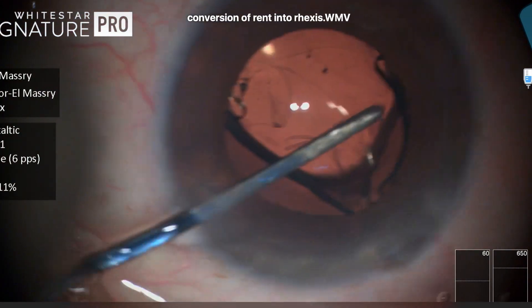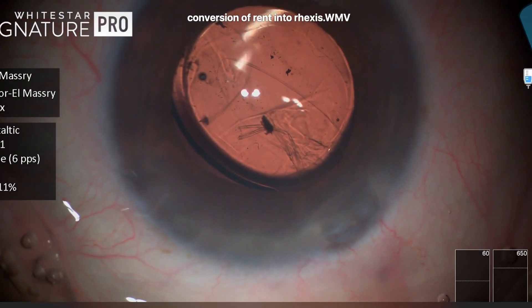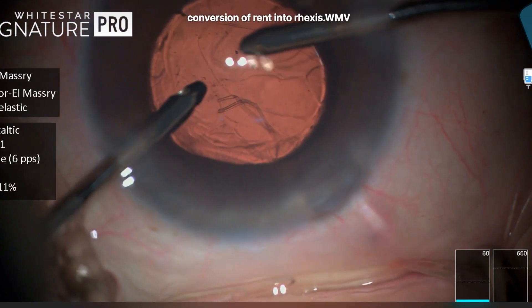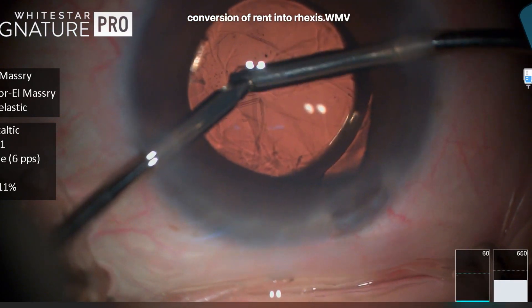I have no financial interest. This beautiful, slow unfolding allowed the lens to be positioned into the bag without any manipulations, and then doing some irrigation aspiration to remove any cortical or epinuclear remnants, as you can see here.